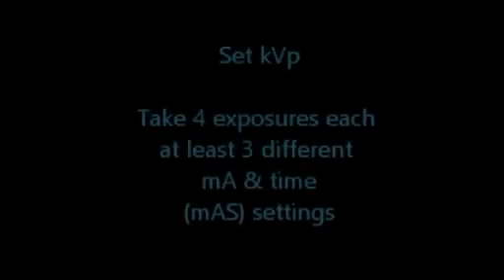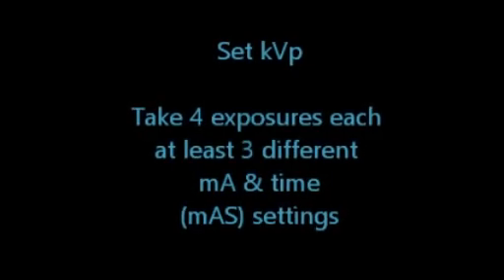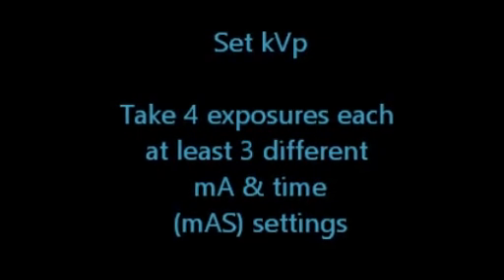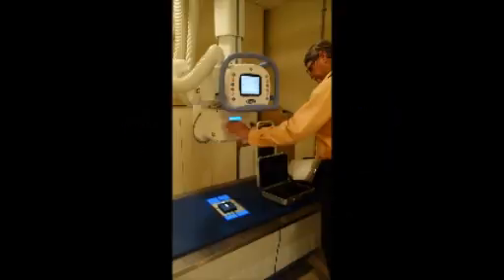You should perform this reproducibility test for at least 3 different mA or mAs settings using the same kVp. Ideally, these should be across the range of mA or mAs typically used on this X-ray machine.